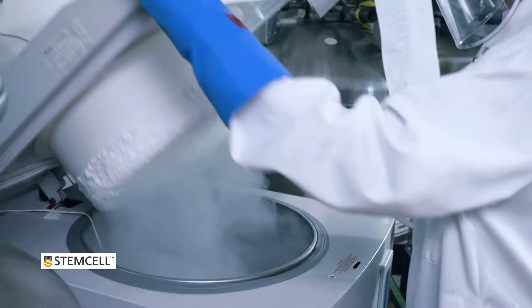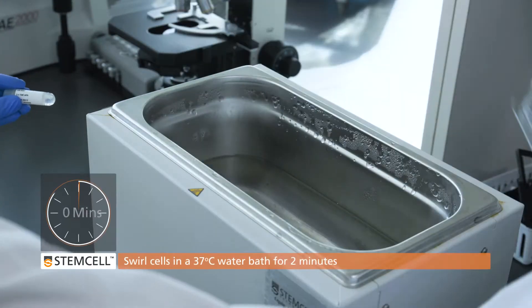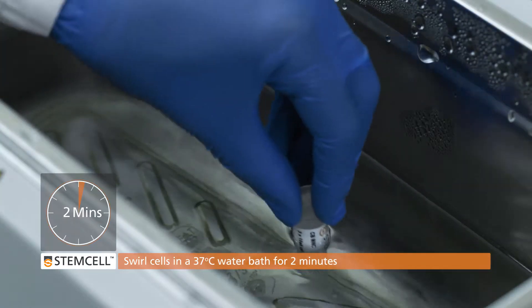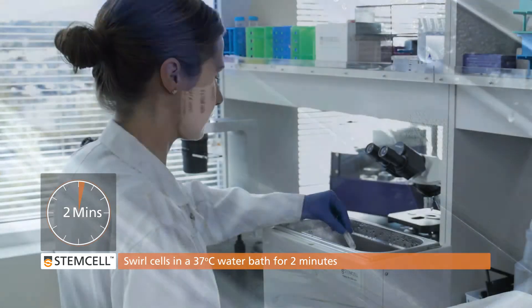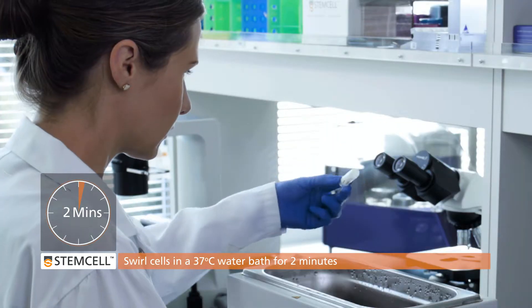Aim to complete the entire CFU procedure within 1 hour. Remove the vial of cells from liquid nitrogen and thaw quickly in a 37 degree Celsius water bath. Holding onto the vial, draw a figure 8 in the water. Do not leave cells unsupervised and take care not to submerge the vial cap. The cells are ready when there is only a small piece of ice left in the vial; this should take approximately 2 minutes.